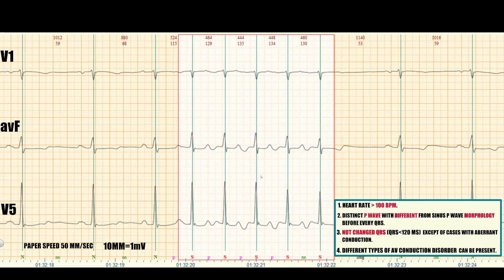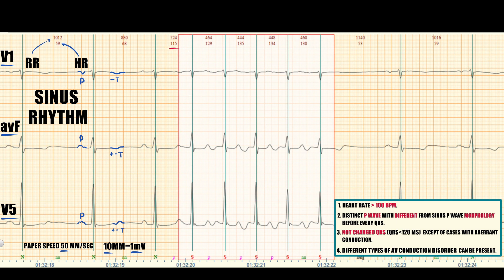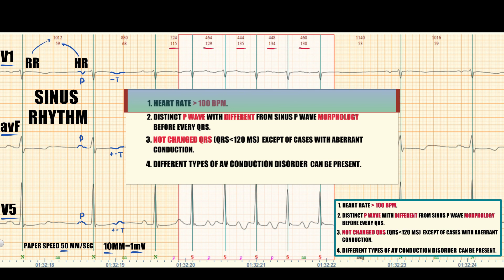Now look at this 24-hour monitoring ECG episode. Here we have only three leads. Paper speed is 50 mm per second. In the beginning we see sinus P-waves indicating sinus rhythm. On top of the ECG we see the heart rate and RR intervals in milliseconds. After this we see an episode with a high heart rate of approximately 130 bpm. This is tachycardia, so the first criterion of focal AT is present.